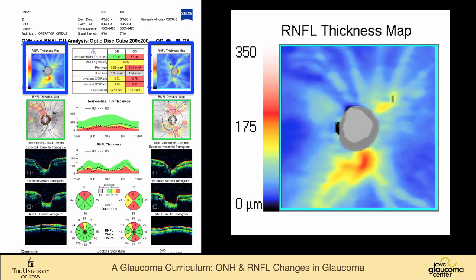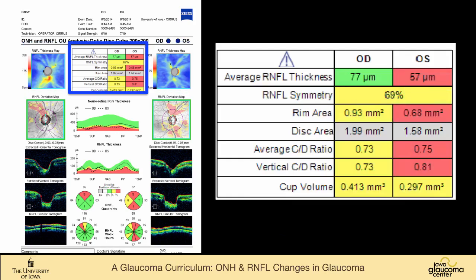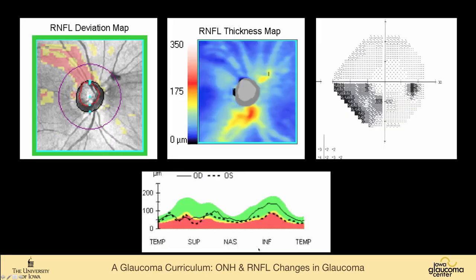A drawing of the nerve fiber layer thickness. You can actually see the defect in the nerve fiber layer in this drawing. And then all of the data. So it shows the average retinal nerve fiber layer thickness at the top, how symmetrical this is. It's not symmetrical. The rim area, disc area, cup to disc ratio. So in this patient, it just all fits together. You can see that there's this superior arcuate defect that shows up in the deviation map and the thickness map, and also shows up in the retinal nerve fiber layer map, and it is reflected in this inferior nasal defect.